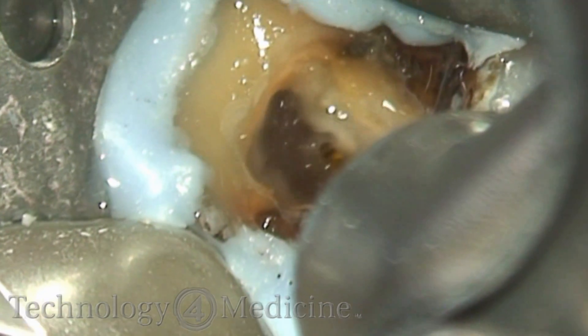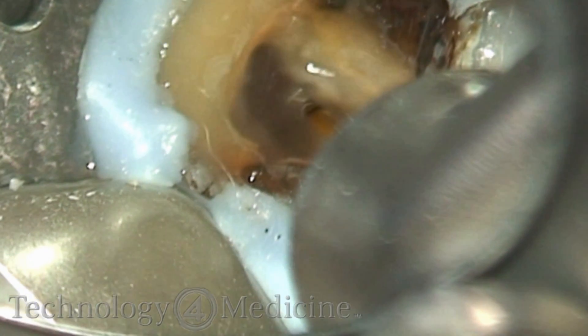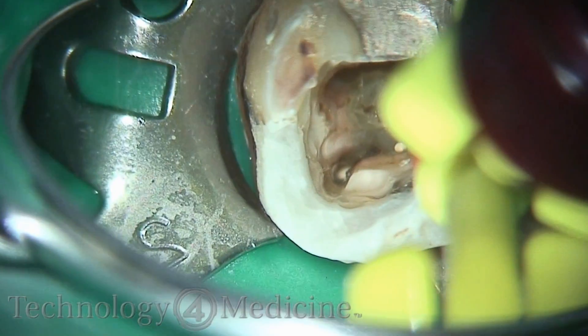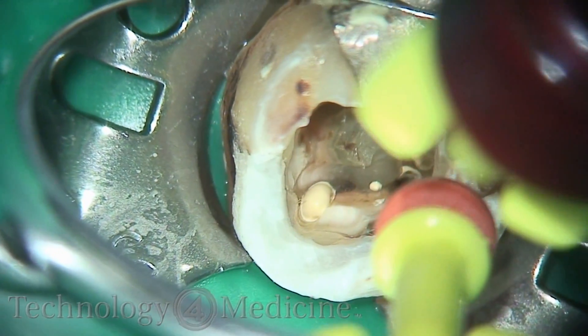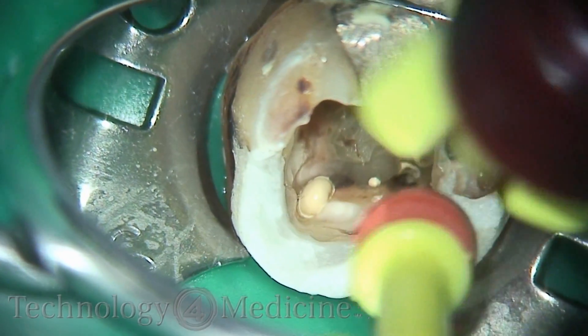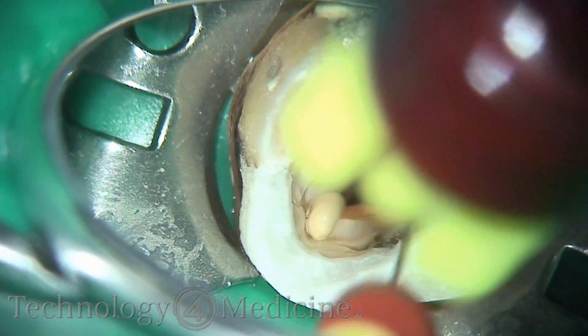I used to joke with Rico that maybe we're doing root canals on the entire arch if we're doing just one tooth with PIPS because it's so powerful. This was one of the first teeth I ever did where I saw anastomosis — filling the mesial buccal canal of a lower molar and watching it come up the mesial lingual canal of a lower first molar.